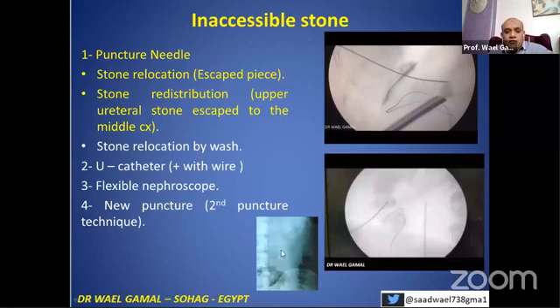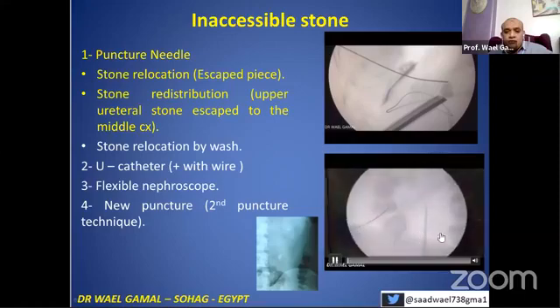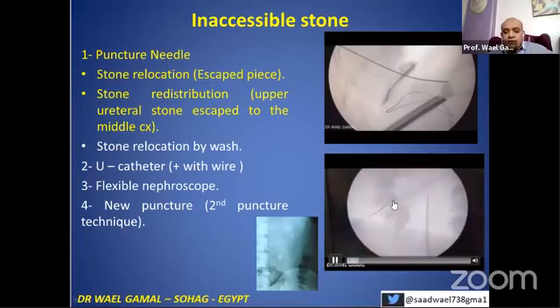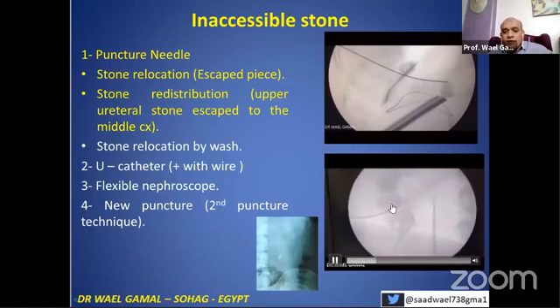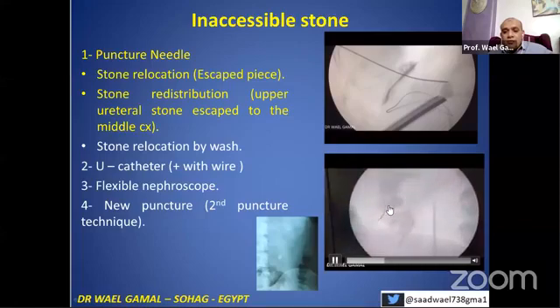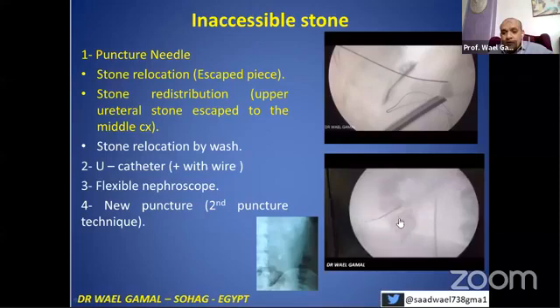In this case: stone in the upper calyx, left side, and two lower calyceal stones. You perform push-back — there is a stone in the middle calyx. From the start, you can redistribute the stone by pushing it here. Before doing the puncture, try to push the stone outside the calyx — it may be successful and it may not.